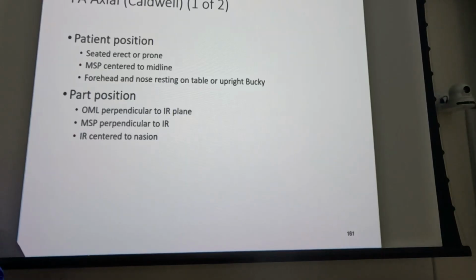Now, what if the patient can't be prone? What if you can't shoot PA? Can you shoot an AP? Answer is yes. And it gets a little bit more complicated in doing so.